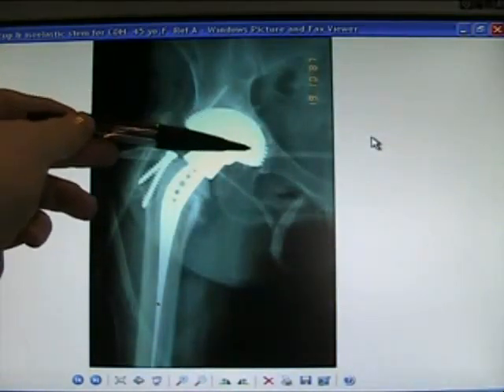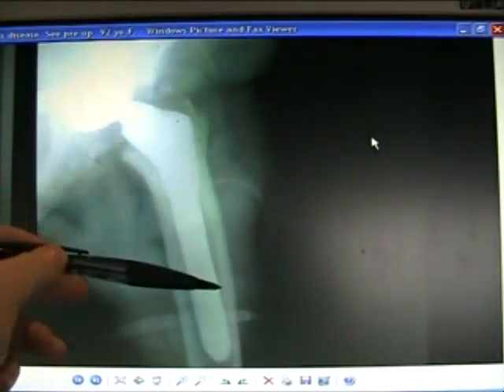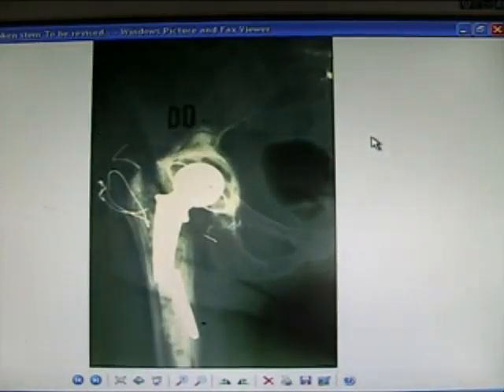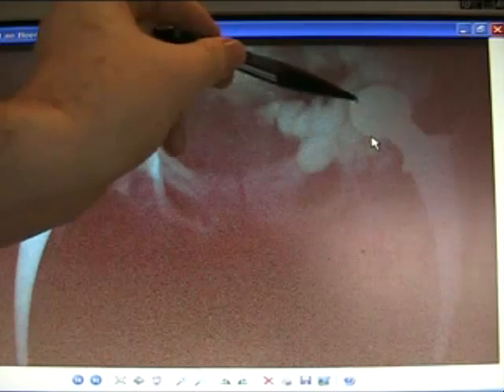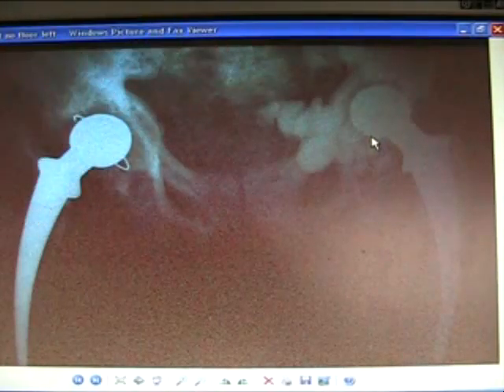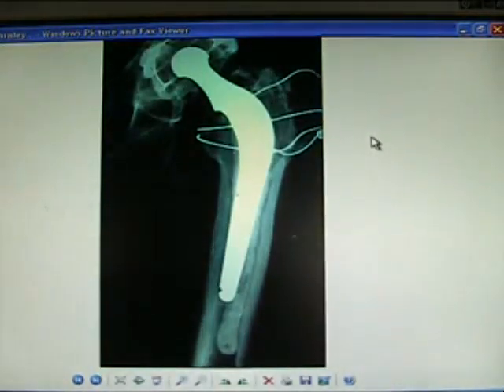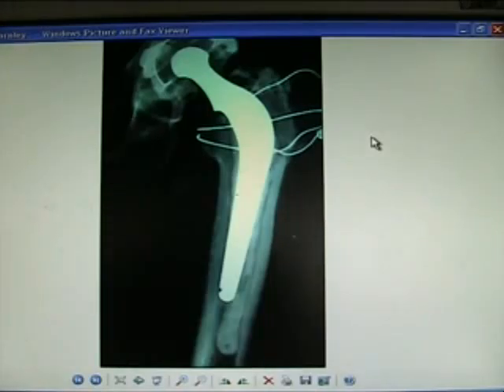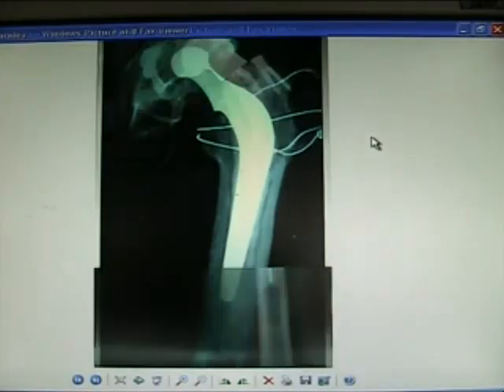Here's a gripper cup and an isoelastic stem — a non-cemented hip replacement. Paget's disease. A Petruzio case. A long-standing case with loosening and fracture of the implant — look at all the cement going into the pelvis. Revision will be very difficult. The Charnley hip was good in the 60s and 70s but has now been superseded.